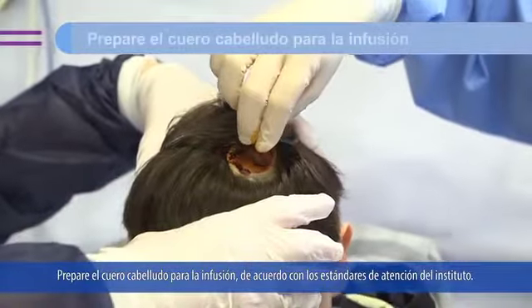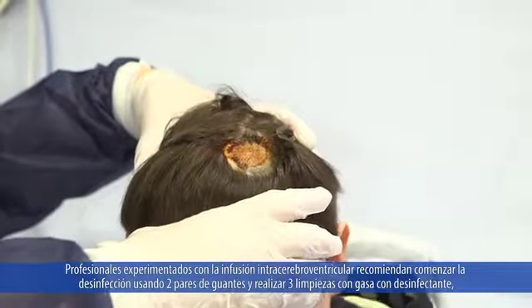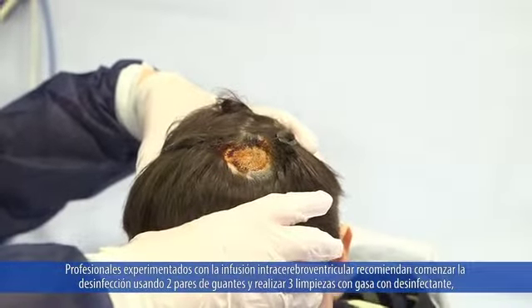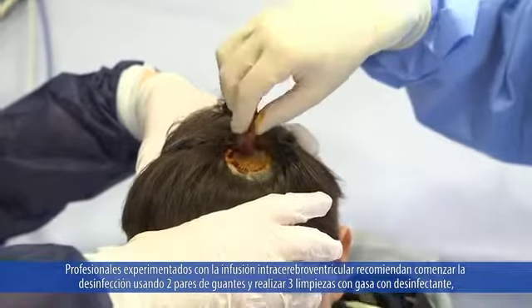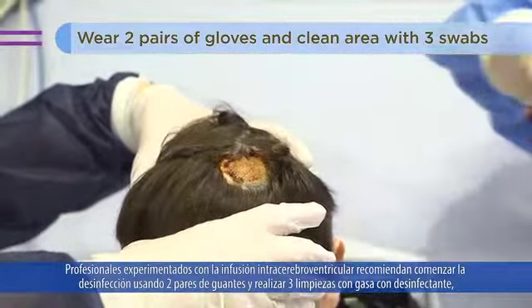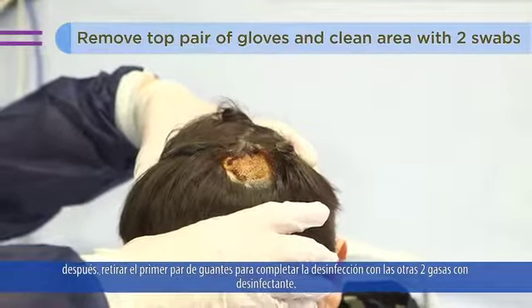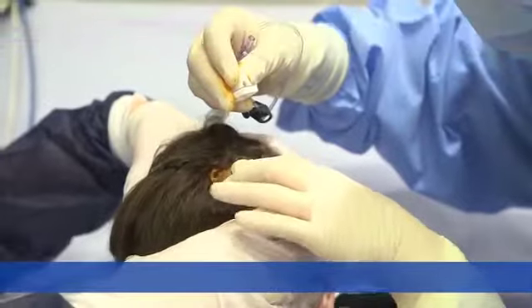Prepare the scalp for infusion as per your institution's standard of care. Clinicians experienced with intracerebroventricular infusion recommend beginning the disinfection process by wearing 2 pairs of gloves and using 3 swabs, then removing the top pair of gloves to complete disinfection with the remaining 2 swabs.